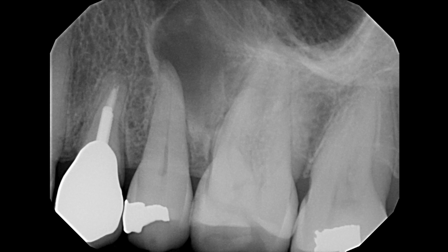Referred the case. About a month later, I got the specialist note saying that 2.5 is perfectly healthy, 2.6 has a root fracture, and it's actually a cyst around the 2.5, not a sinus, not a lesion. So we made the plan to extract the 2.6, do a massive cystic curettage. It was a huge cyst cavity with a very large round carbide on the implant handpiece under saline irrigation, and then placed a bunch of bone graft material.